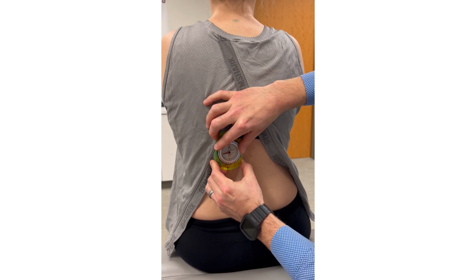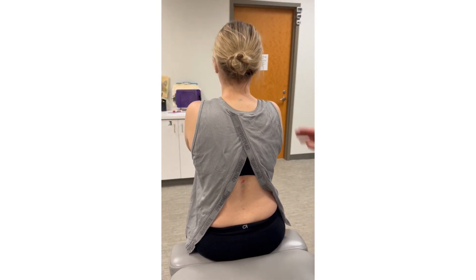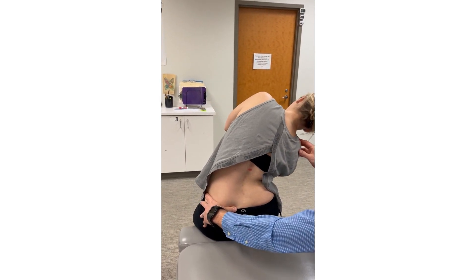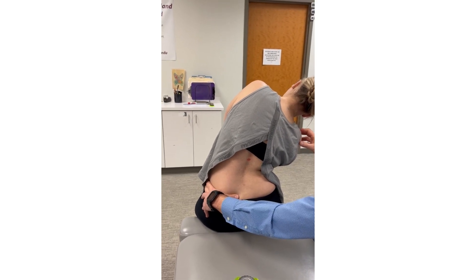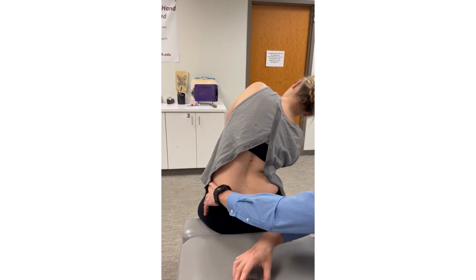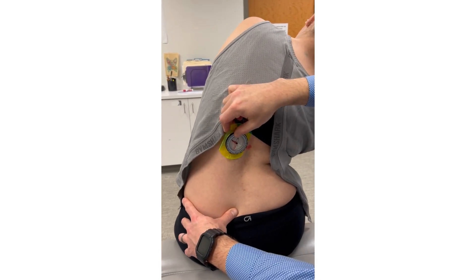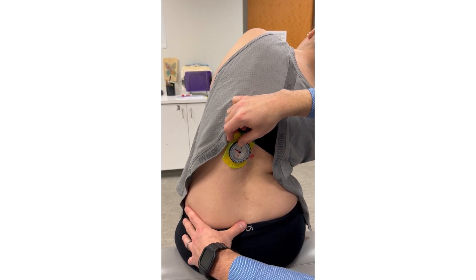At T12, we'll place the inclinometer down. Have you tip to your right — I'm going to stabilize the pelvis with my left hand over the iliac crest. Then we can take our measurement. With the inclinometer, we're creating a tangent line with the straight edge of the inclinometer.